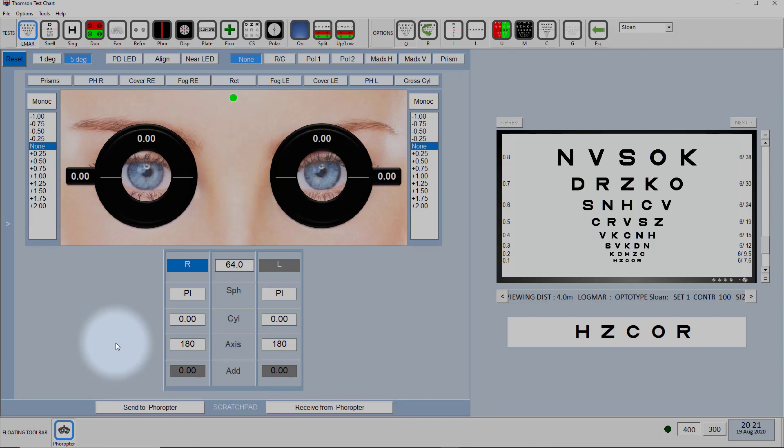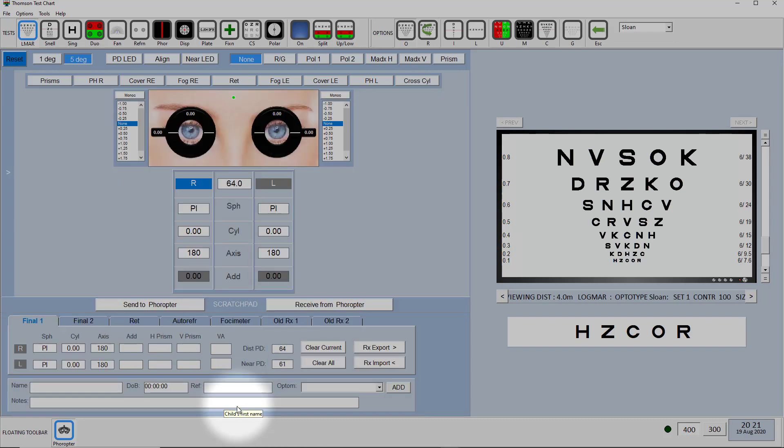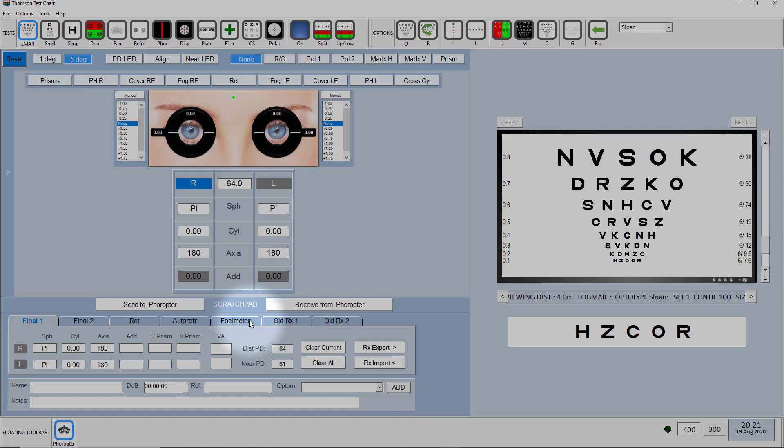Now to access the scratch pad you just click on scratch pad at the bottom here. It will then expand and essentially the scratch pad is seven memories of the patient's prescription and they're labeled old RX 1 and 2, phoropter, autorefractor, retinoscopy and two final prescriptions.